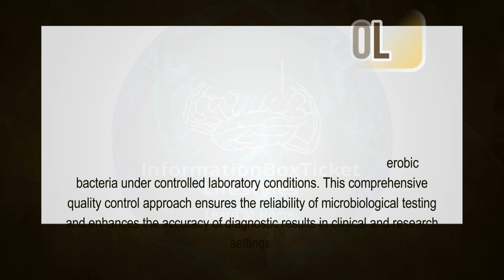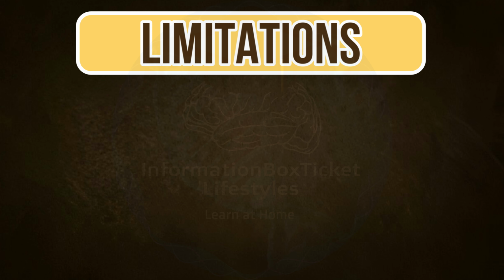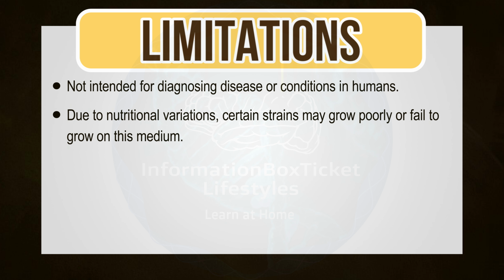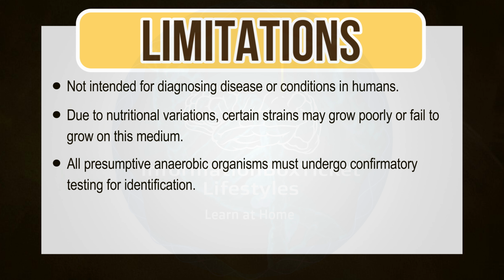Limitations of Brucella agar. It is not intended for diagnosing disease or conditions in humans. Due to nutritional variations, certain strains may grow poorly or fail to grow on this medium. All presumptive anaerobic organisms must undergo confirmatory testing for identification.